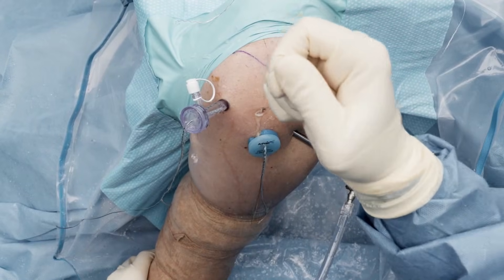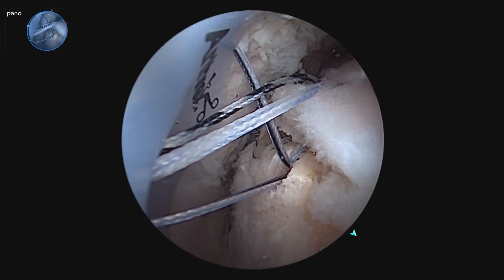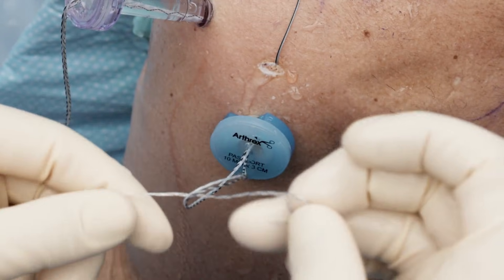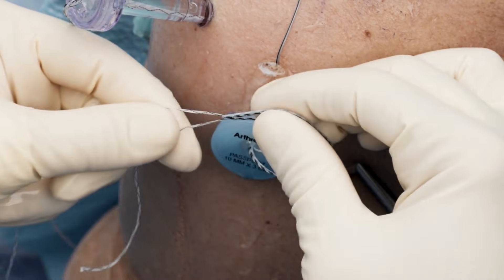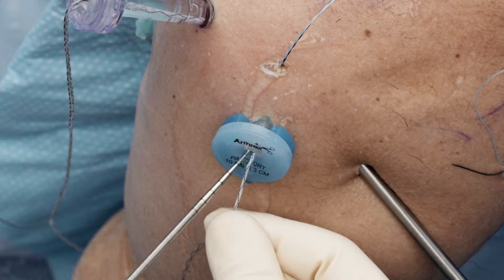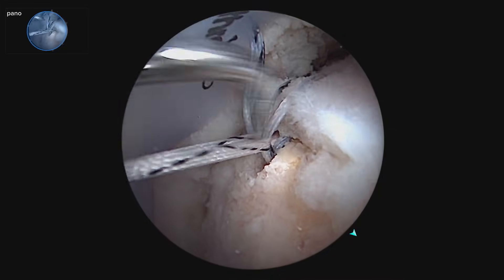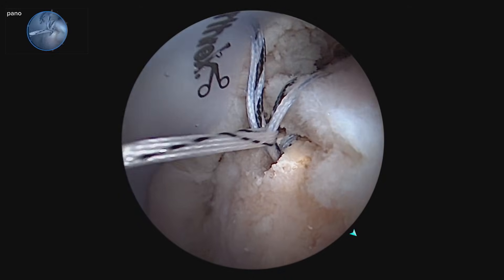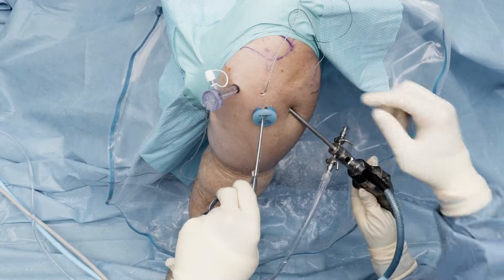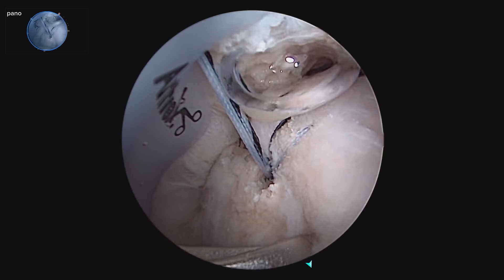We will utilize the shuttle suture to put a little tension on the loop on the working repair sutures so that we have a little counter tension. This counter tension just helps keep things from getting all twisted up. As I bring it in, look how nice and straight it kept my repair sutures on that tissue. Now I could remove the suture that was helping maintain the orientation, and we're going to take both of these sutures and seal that down to bone.